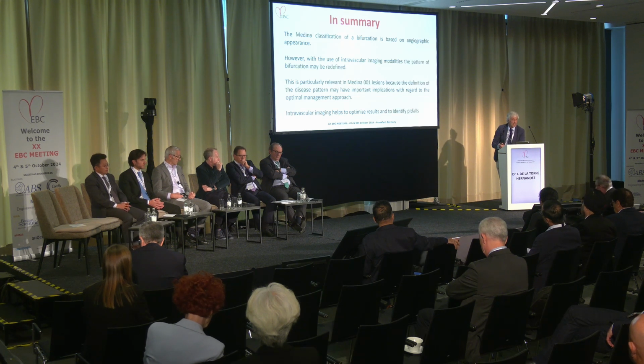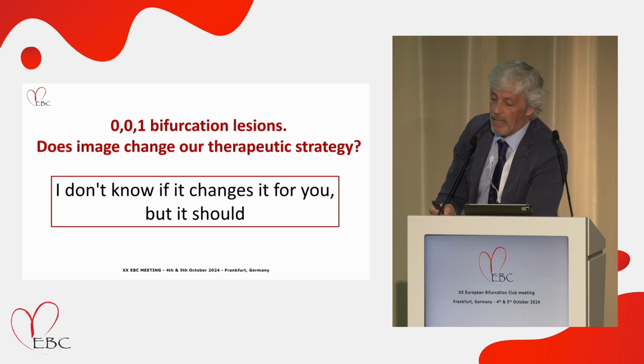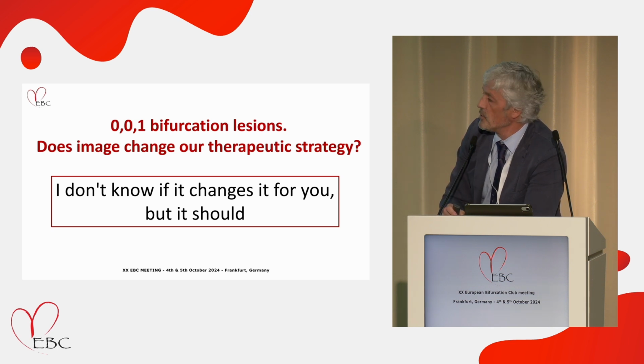A clinician would say, why are you treating these lesions? You have more MACE than the problems that leaving the lesion behind with medical treatment could be associated with. Then we, as interventionalists, have to be very careful with this. So my answer to the question, does imaging change our therapeutic strategy? It could be, I don't know if it changed for you, but it should. And I think that's the conclusion that I can give you. Thank you.